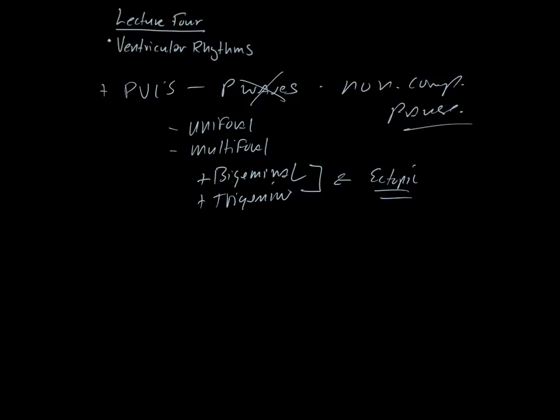So we could use this with PACs, PJCs, and PVCs, but not the heart blocks. The conduction pattern, specifically the second degree, right? If you had 3 P waves to 1 QRS, you would not say that was trigeminy. You would say that was a 3 to 1 conduction pattern. You guys okay there? Cool.